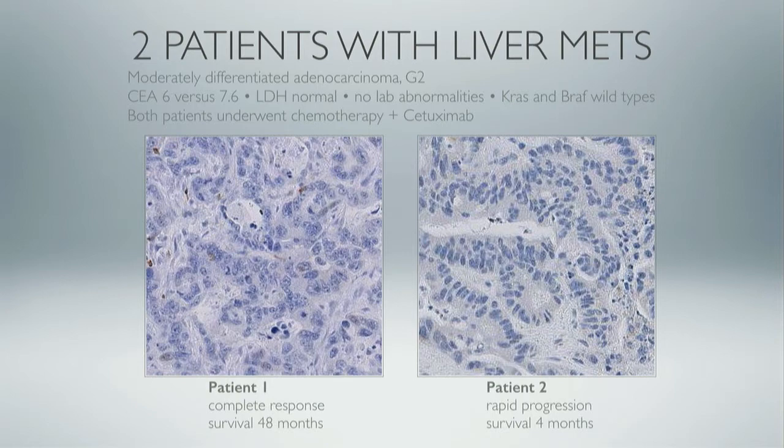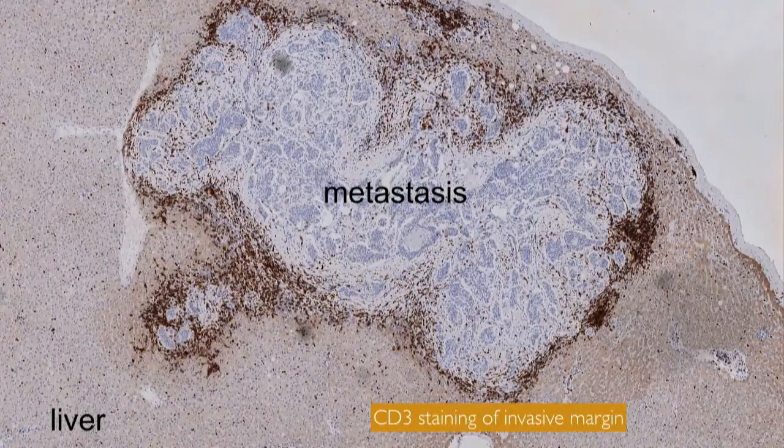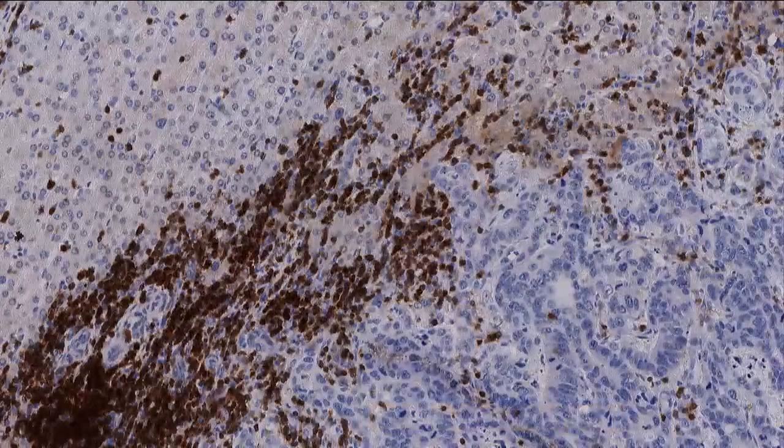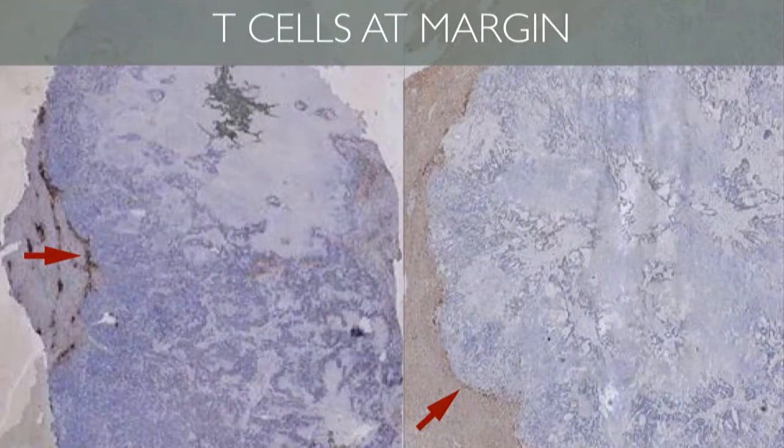And they look pretty much identical until you look at the edges, the seams. And that's where it shows you that the patient that did well had strong T-cell markers at the periphery. So we're learning that tumor morphology is very much driven by the environment that it finds itself in, and that's the survival statistics. And now we've got tools to allow us to measure that and treat that.